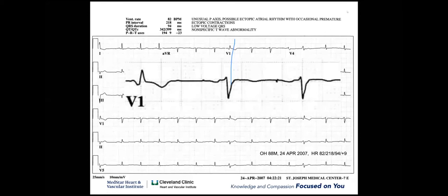This was a report confirmed by a cardiologist, and that's fine. I mean, that is something that we will miss sometimes. But when we see some artifact, we should look back to see if we can see it somewhere else. So it was basically an atrial pace rhythm and PVC with low voltage ECG.